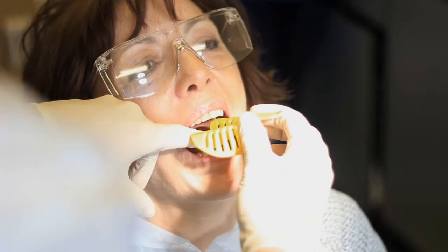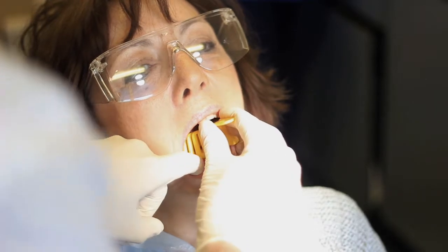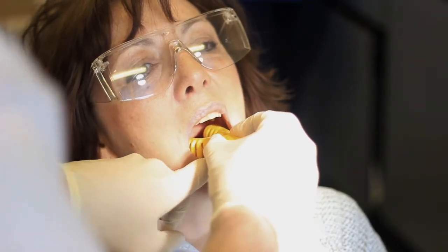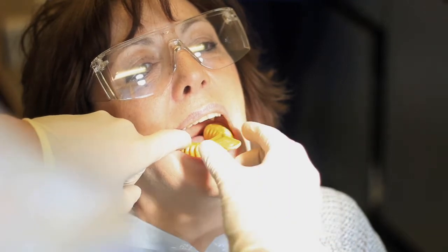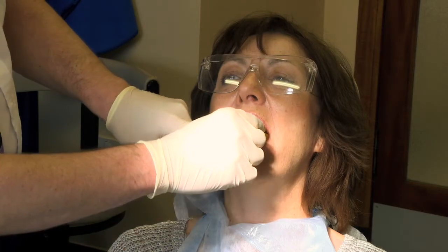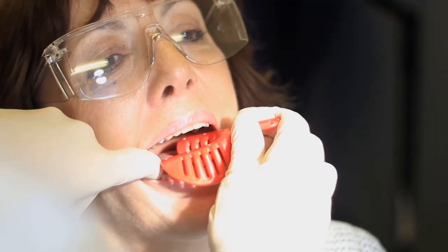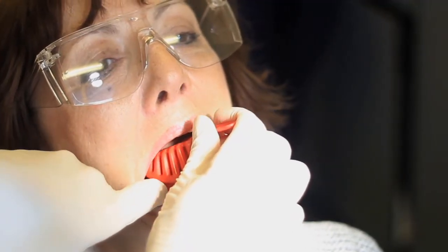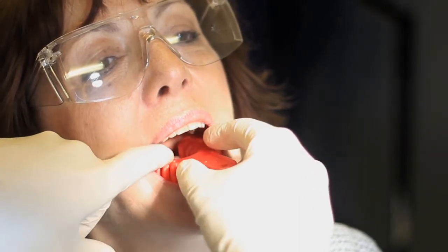What I'm going to do is just stretch your cheek out the way so we can fit the impression tray in here. And we'll see how that fits in over your lower teeth. That's not bad, but it's probably a little bit small, so we'll take that out and we'll try the medium size and see how that fits. So once again, we'll just stretch your cheek out the way and see how that will fit over your lower teeth. And that looks to be a much better size now.